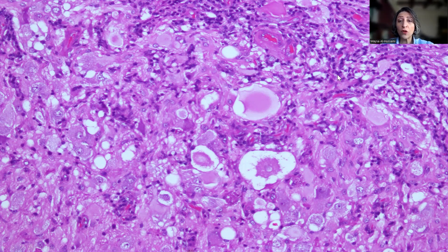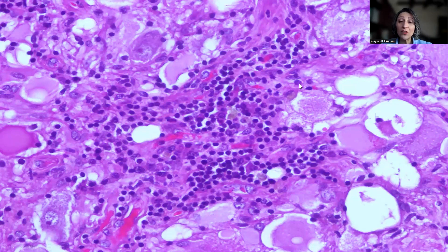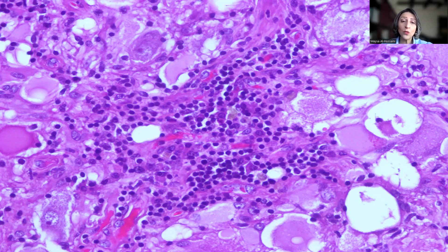In between those ganglion cells, the spindly cells are the glial component. On high-power magnification, one important feature of ganglion glioma is the presence of inflammatory infiltrate around the blood vessels. In particular, you will see plasma cells around the vessels as well as in the interstitium between the ganglion cells. This is an excellent clue that we're dealing with a ganglion glioma.